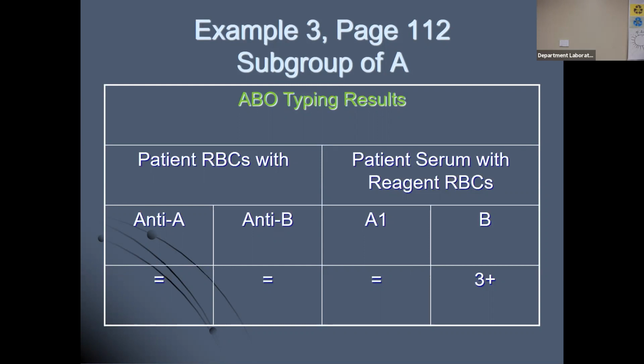Okay. So what is missing? One of our reagents that is actually not included on your front type testing. Anti-A,B. All right, so A,B. So your first step in resolving this discrepancy is to run anti-A,B. If your anti-A,B is positive, remember A,B will react with the A antigen and the B antigen. It is used to confirm group O's.